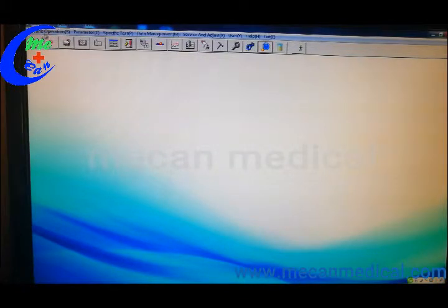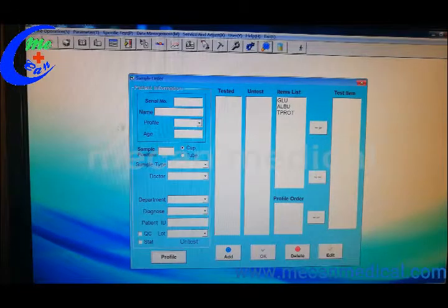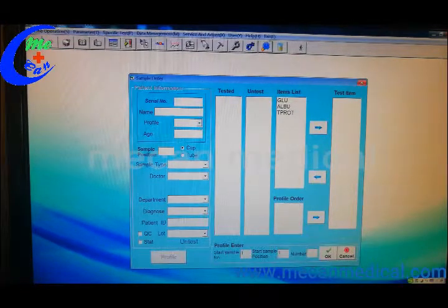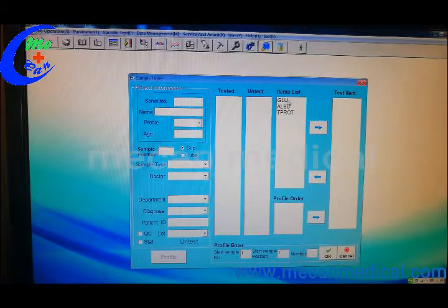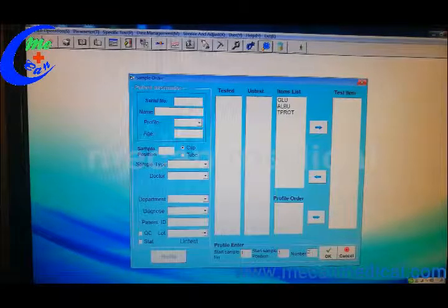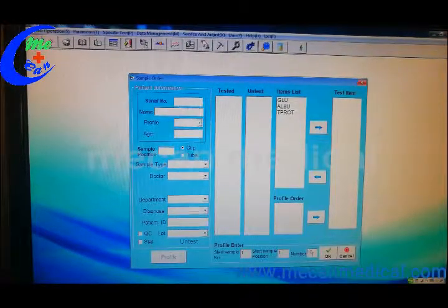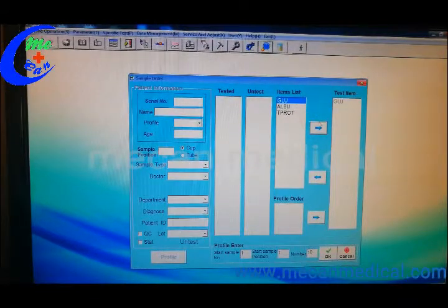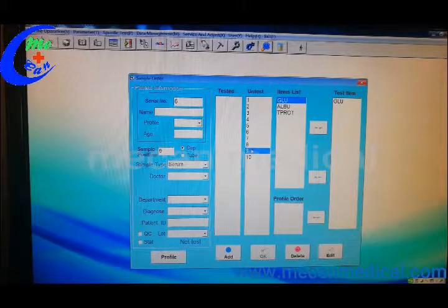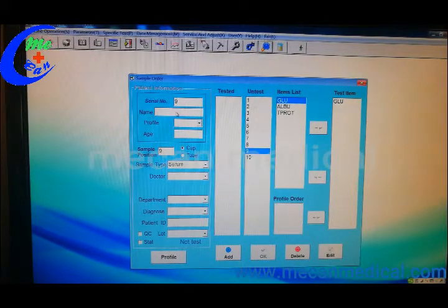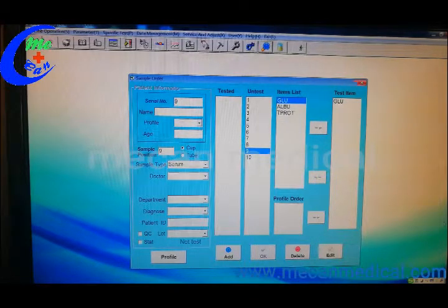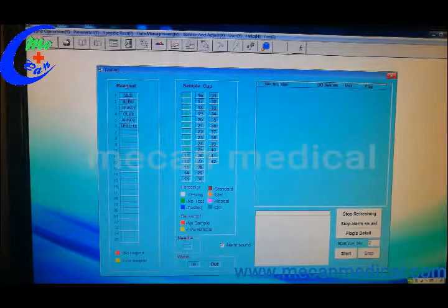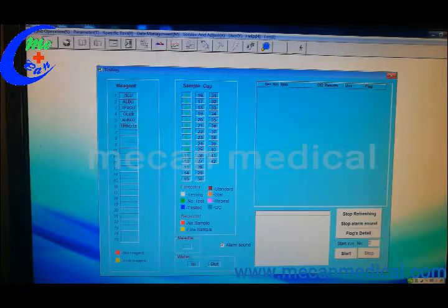And then you can go inside the sample order and choose the profile numbers. You can adjust the name profile from here, the sample information from here, and then you can go to the testing page like this.